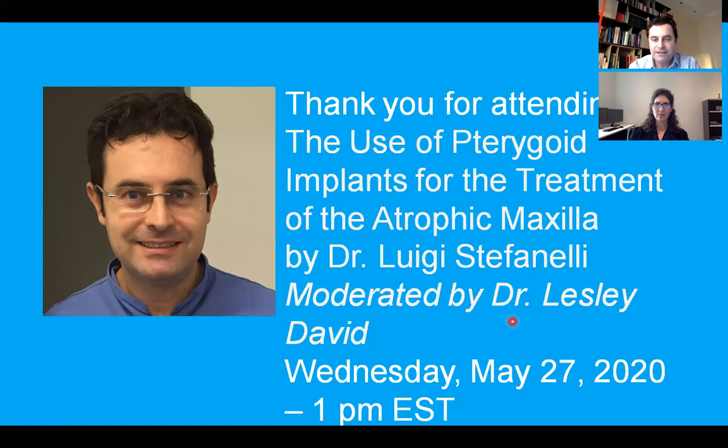Sometimes in some courses, I make one implant freehand and the other with the dynamic navigation system. But in my practice, I treat all patients using the dynamic navigation system when I plan to insert a pterygoid implant.